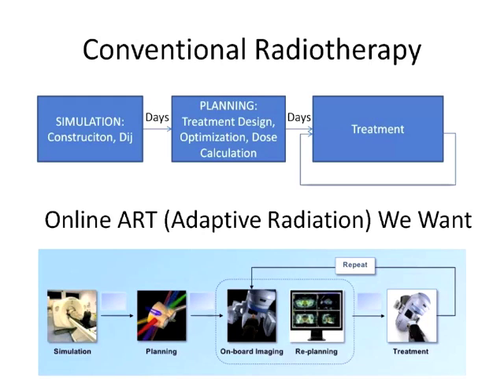So considering all these things, if you can get a similar performance, GPU was a very attractive tool because you can have one or two workstations inside the treatment room and get similar parallel performances there.